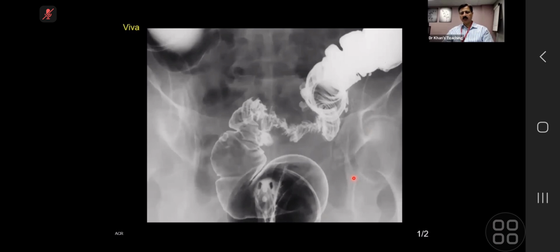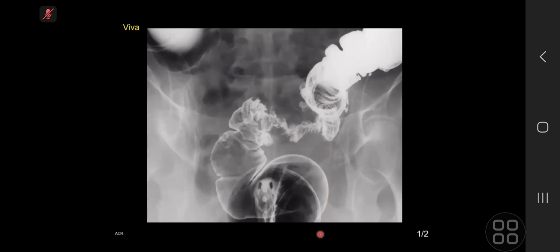And you see it in each and every patient, you know. Diverticular, yeah, diverticulosis, or diverticulitis. Can you correlate the two then? Yeah, so appearances are in keeping with diverticular stricture because of diverticulitis.